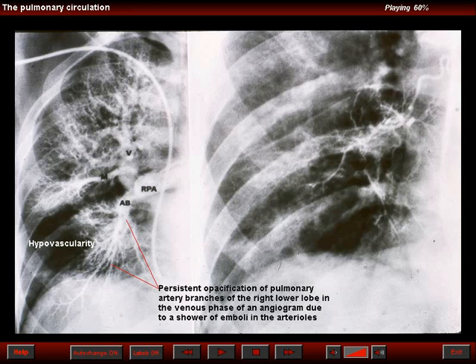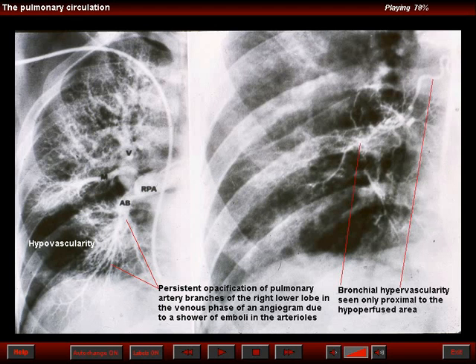This angiogram shows asymmetric pulmonary blood flow, and we note the opacification of the right upper lobe pulmonary veins simultaneous to the opacification of the pulmonary arteries that could not drain because of the presence of a shower of emboli. To your right is a selective bronchial arteriogram of the same patient. Note the slight increase in the number and size of the bronchial arteries, but they appear quite small and are only seen in the medial aspect of the lung.